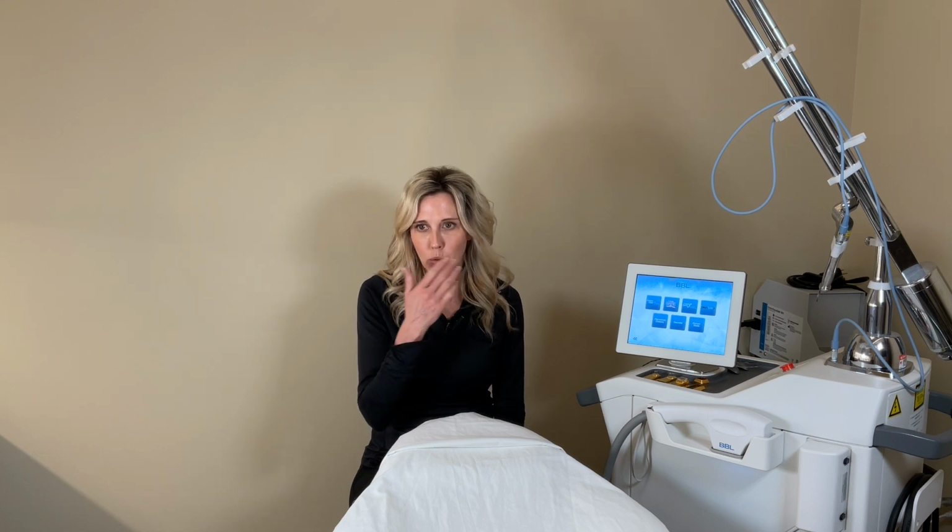So prior to having the procedures, we love to get baseline photos. And it's not only for the patient having it done, but it's also for us. So we use a camera called the Vizia, and that is a software that takes pictures from 3 sides. But the one thing I love about it is it grades your colors, it grades your sun damage and your brown spots. It also grades how much redness you have. But it also gives me another piece of information, which is what color is their natural skin.